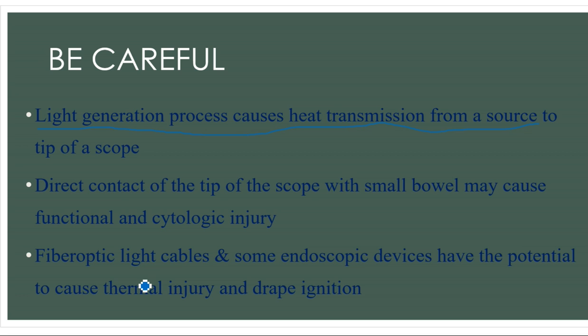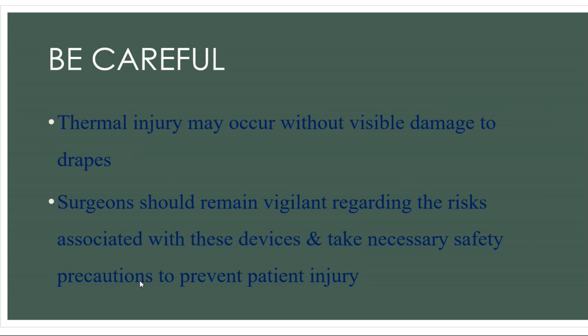So please be careful, especially this is true for surgeries which require a longer duration. The thermal injury may occur without visible damage to the drapes, meaning the drapes are fine. But even the area of the patient lying under the drapes may sustain thermal injury if you're touching the tip of the laparoscope or the tip of the light cable over that particular area. So we must remain vigilant regarding the risk associated with these devices, and we must take precautions to prevent patient injury.